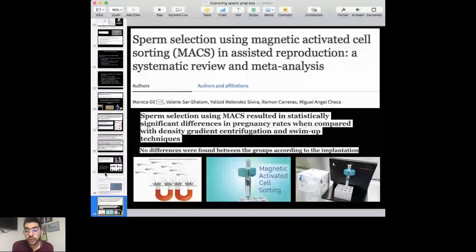Which kit is good for DNA fragmentation, which can be used at RT, I'm thinking is room temperature. There is no kit which can be used at room temperature where you're doing staining, because what you're wanting to do with increasing the temperature is to denature the DNA and then stain that. So in such a scenario, I would not recommend any kit if you're wanting to do it at room temperature.